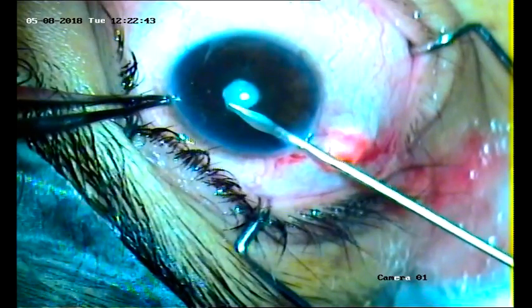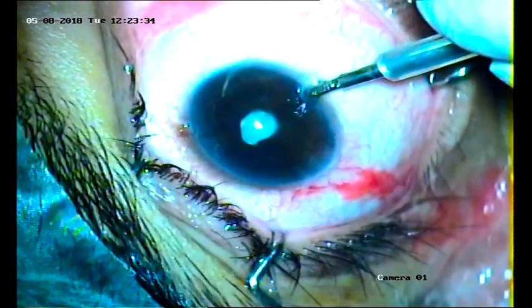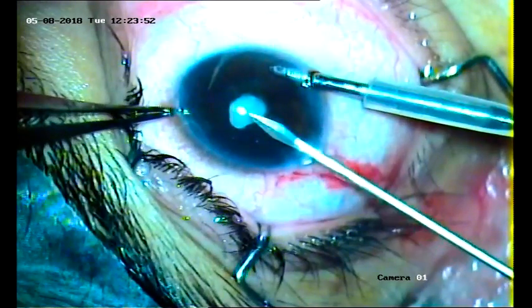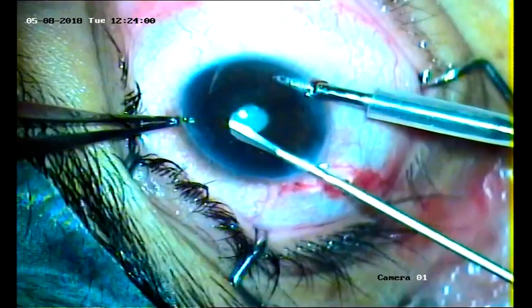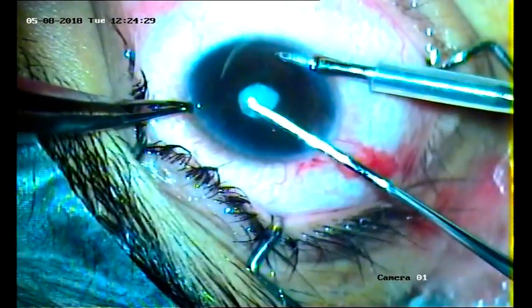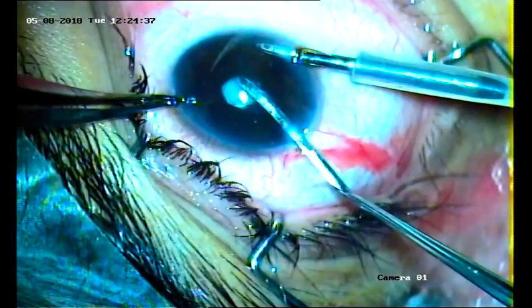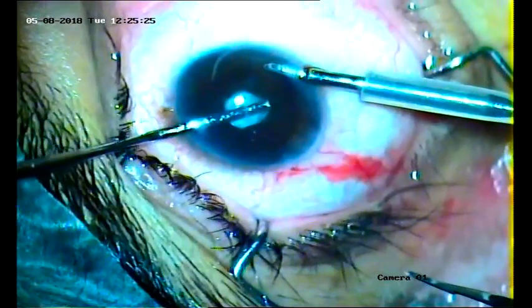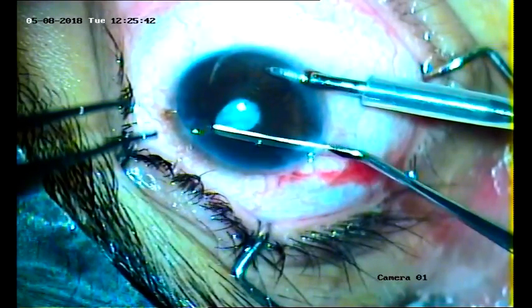We are trying to separate the pupillary border from the capsule — the adhesions we are going to break. As there is hypotony, an anterior chamber maintainer is applied to maintain the anterior chamber depth for the manipulations. With the help of an iris repositor and crescent knife, which is also used to break the synechiae, we separated the pupillary edge from the capsule 360 degrees. Adhesions were broken.